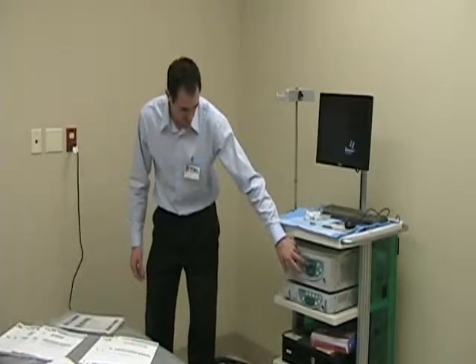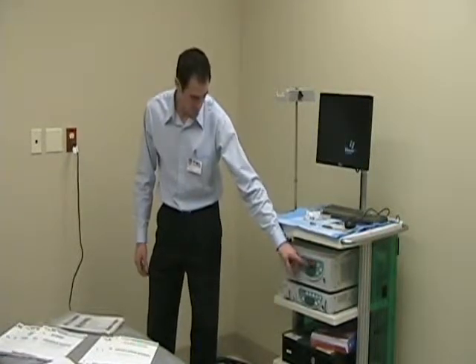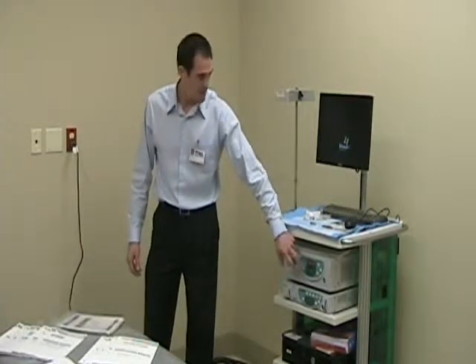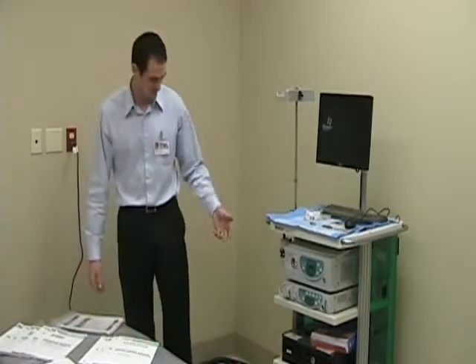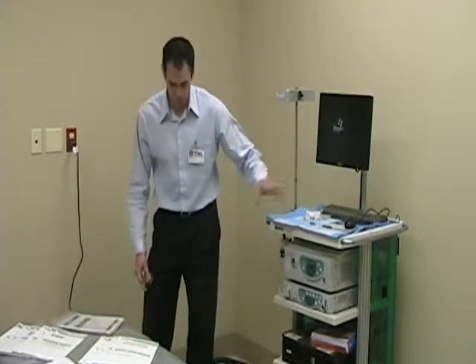And how you can tell is there's 10 bars right here. And there's a lamp life illumination, and then there's illumination. So when the lamp is not on, it's in lamp life, and that's showing that it's the first 10 hours, or 30 hours. 30 times the 10, 300 hours. So it's brand new, it's good. So you'll notice once it gets up to the second bar, there'll probably be a message come up here that says lamp needs to be replaced. It's not going to go out. Plus there's a backup lamp on here, so you'll never lose image or light. But just kind of a heads up, like, you need to order this, if it takes a week or 2 to order something. So, anyway, it's pretty simple. Light levels, up and down. We'll go over this when I plug the scope in.